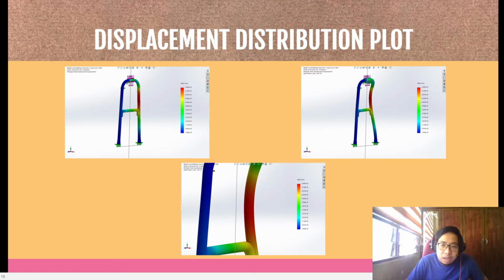For the high quality displacement distribution, the maximum displacement is 0.06694 mm in the red color, while in the dark blue region, the lowest displacement is 0.001 mm. Next, for the draft quality mesh, the maximum displacement is 0.06553 mm, and in the dark blue region, the minimum displacement is 0.001 mm.